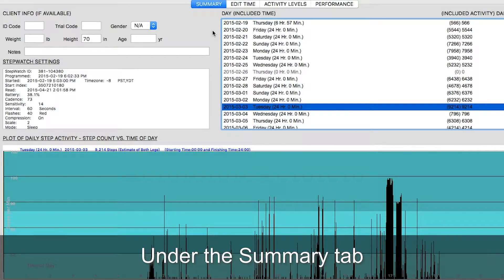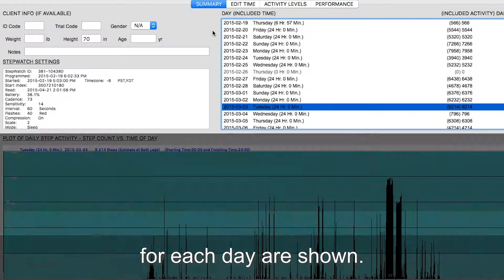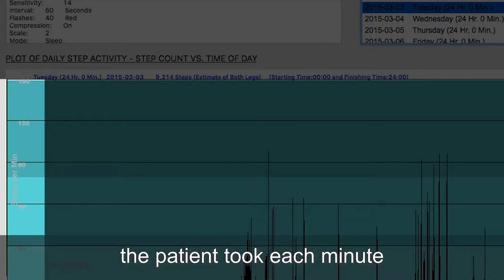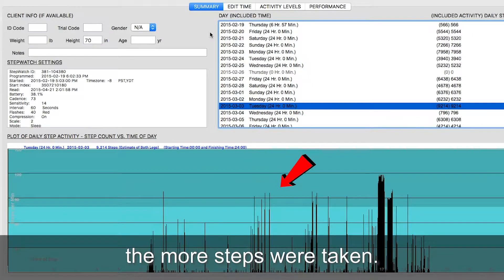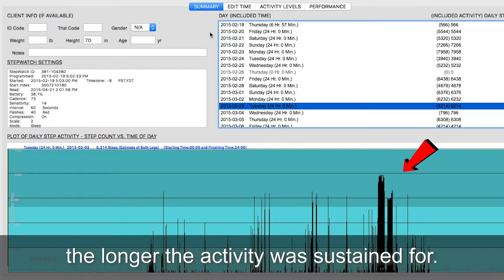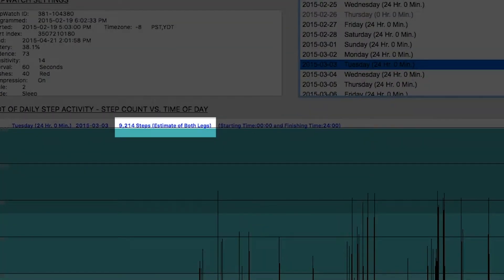Under the Summary tab, the patient information and daily step count results for each day are shown. For each graph, the Y axis is the number of steps the patient took each minute and the X axis is the time of day. The higher the black bar, the more steps were taken. The wider the black bar, the longer the activity was sustained for. The number of steps taken each day is written above the graph.